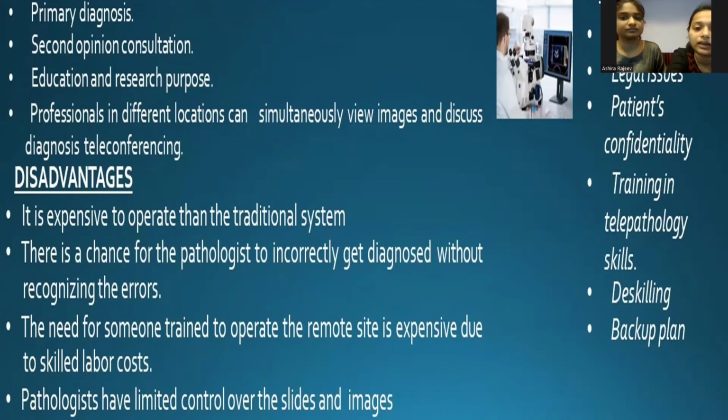Legal issues arise when telepathology service is used from outside national boundaries. For example, in European Union, the registration of reporting pathologists must be recognized by the regulatory body of the European Union member state, an essential requirement in order to maintain proper standards of reporting. In case of patient's confidentiality, expert advice on data protection is needed if patient's identifiable or potentially identifiable information is being transmitted.